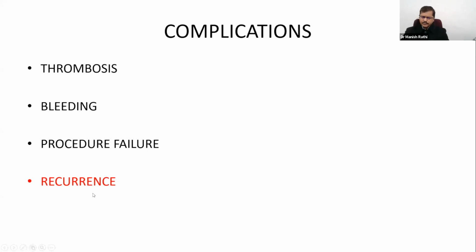And finally, this problem is with all the procedures dealing with high flow fistula, that you will have recurrence sometime or another, because the compliance of the system is so huge. Unless you close this fistula, there will be recurrence. Even the plication of the fistula has been shown to have significant recurrence rate. So these are some of the complications.